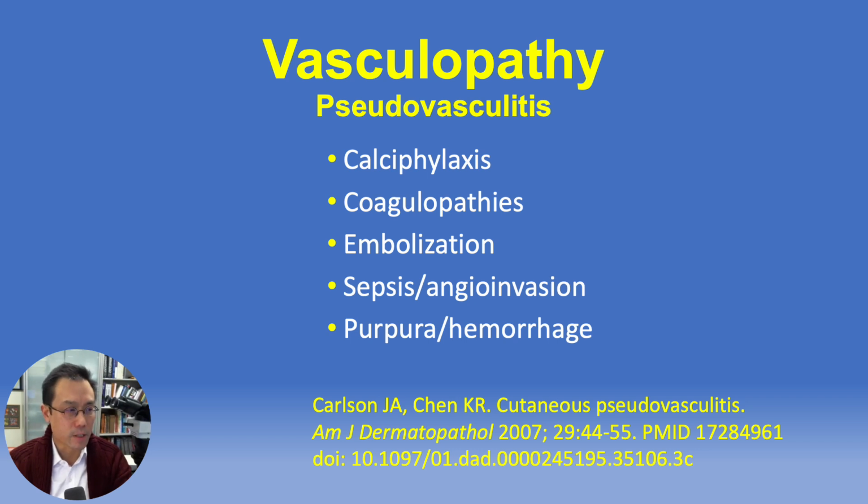Calciphylaxis often has a special category in and of itself, but otherwise there's a very broad, long list of coagulopathies, also various embolic phenomena, sepsis with angioinvasive pathogens, and then under the heading of pseudovasculitis, Carlson and Chen have also included nonspecific purpura, which can clinically and histologically mimic vasculitis, but is actually not affecting the vessels at all, either inflammatory or otherwise.